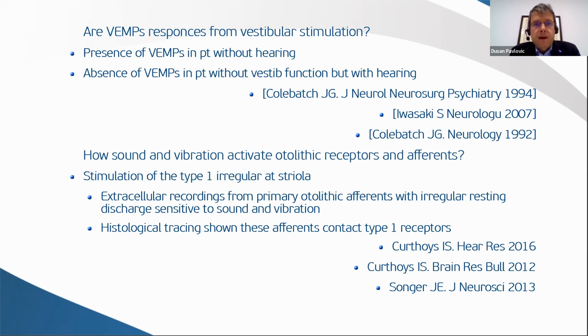Also, we can't get a VEMP response in a normally hearing ear without vestibular function. Examples are patients who have gone through vestibular nerve section, so we definitely know that they don't have vestibular function in that ear, and we don't get a response in those patients.